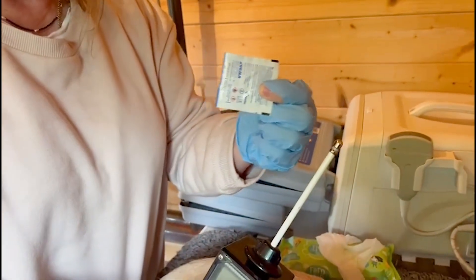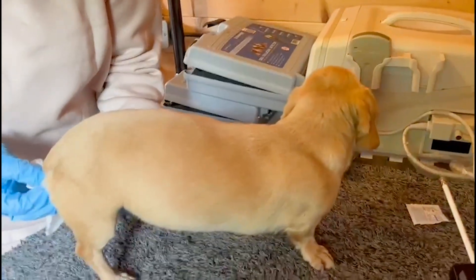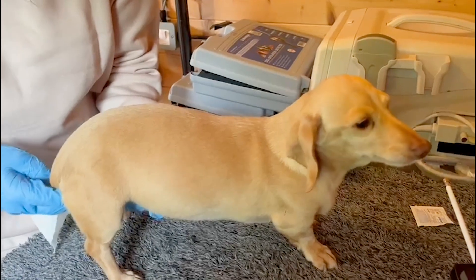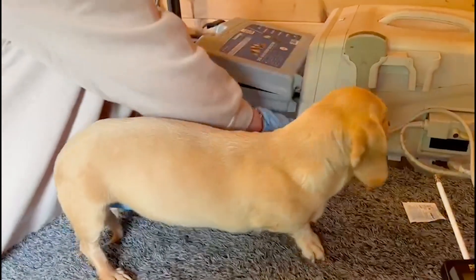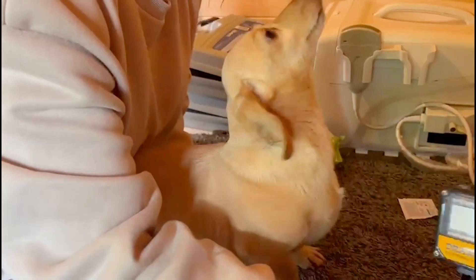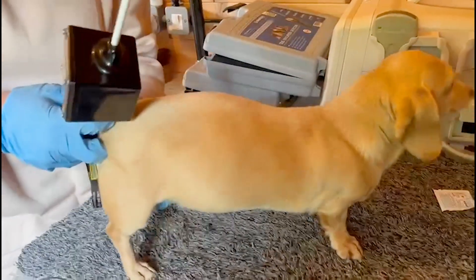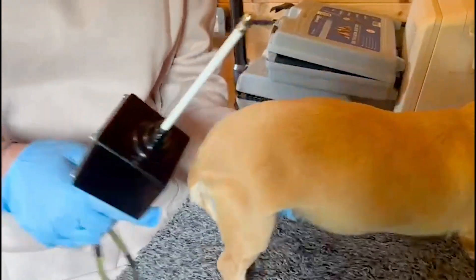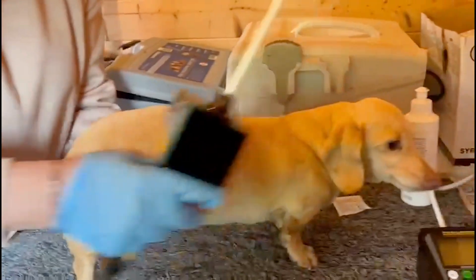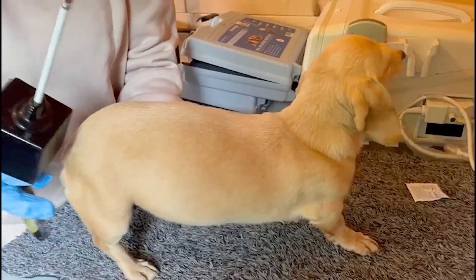One of the most important things is to keep everything clean. I have disinfected everything. This is Gracie, our model. We wipe her back first — it's clean, but we're going to wipe it anyway. She's not in season, but we're going to show you. There's no need to insert all three devices, so we're going to use our second eldest one.